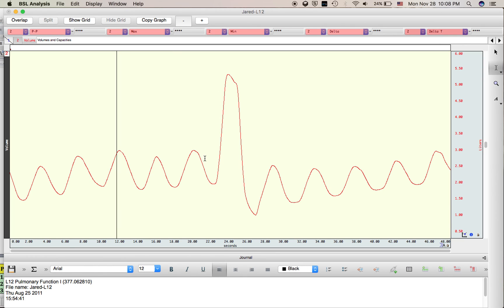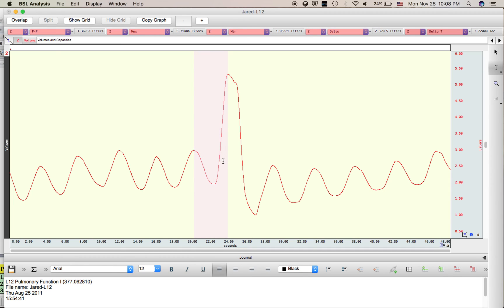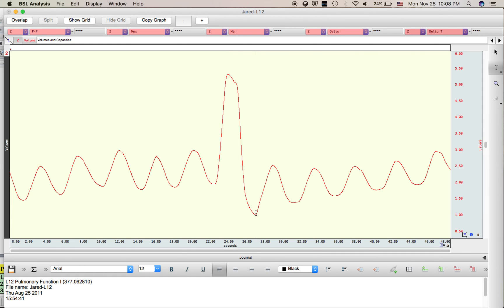If I want to know the IRV — the inspiratory reserve volume — I'm going to highlight from the top of a normal breath and go to the top of my deep inhale. I'll use the delta tool to find the difference between the starting point and the ending point in liters, and that is going to be roughly 2.33 liters. The ERV can be measured by going from the lowest point of the deep exhale to the lowest point of a normal exhale, and that value is going to be roughly 0.39 liters.